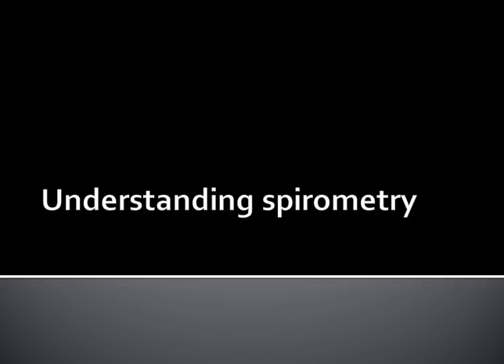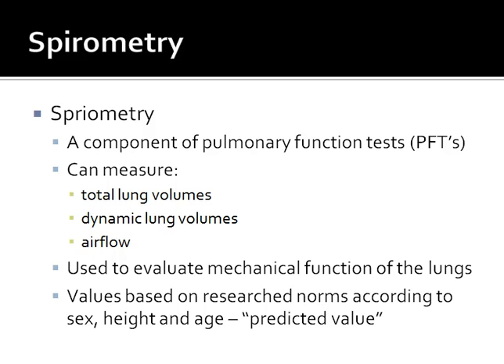So this is a screencast just to recap spirometry as part of the pathology recognition series for the PRP module. We've talked a little bit about lung volumes and what they mean, and spirometry is a way of measuring those lung volumes. Pulmonary function tests can tell us quite a lot about someone's lung function just from basic lung volumes, but also dynamic lung volumes and also airflow.